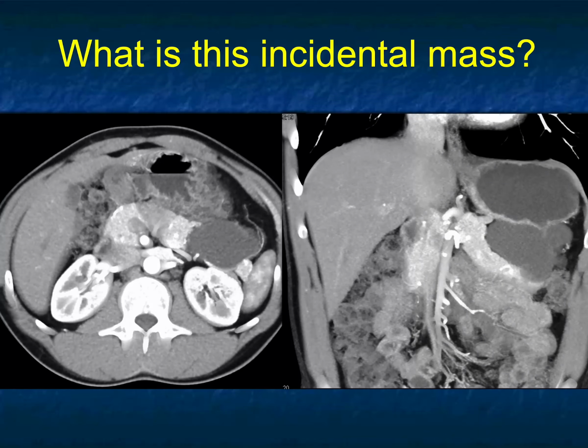Incidental pancreatic mass, it's well-defined, low density, lobulated against the gland. It's hard to tell if it's arising from or abutting the gland. That's the typical appearance, that scalloping, the low density, the homogeneity. That's a lymphoepithelial cyst of the pancreas. Okay, just a wonderful, wonderful example.